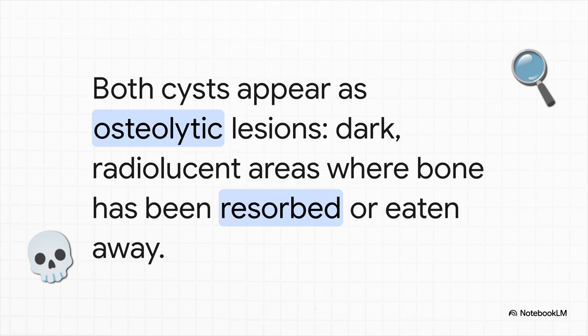That's a technical term, but all it really means is a dark spot on the X-ray where bone has kind of been eaten away. So at first glance, they can look pretty similar. But now we look closer for those telltale signs.